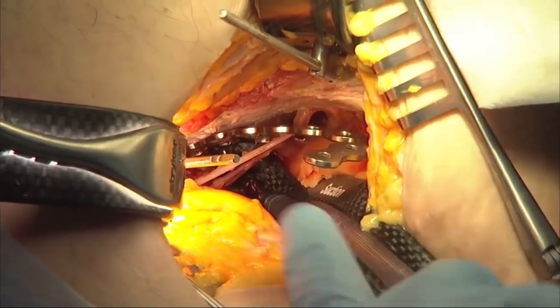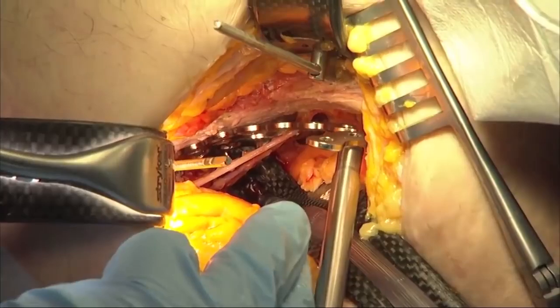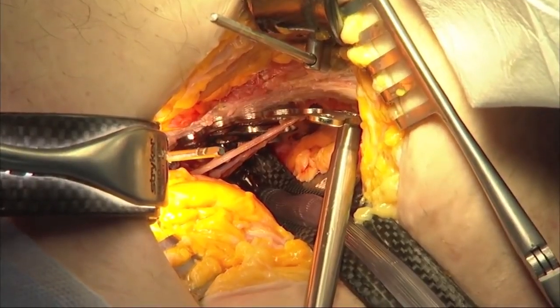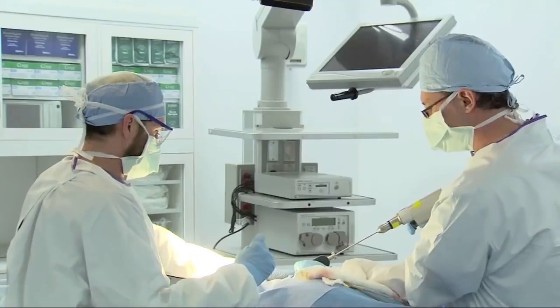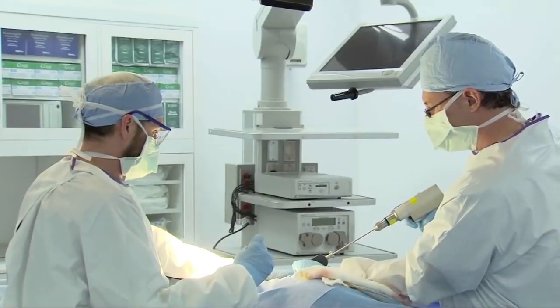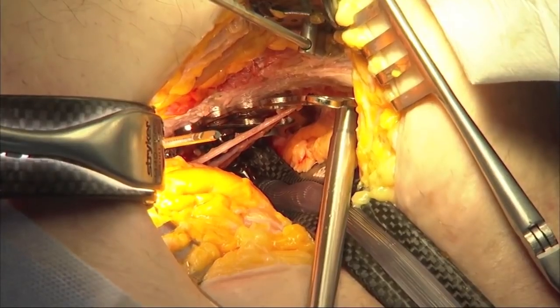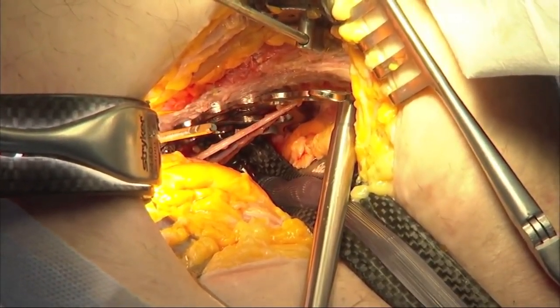In order for this device to work correctly, we have to have another screw in the more anterior aspect of the plate right where we want the bend to occur. And so we're going to use the plate screw insertion handle to place another screw here in the most anterior hole of the plate just behind the pubic body. You need to be careful, you don't want to advance this too far.